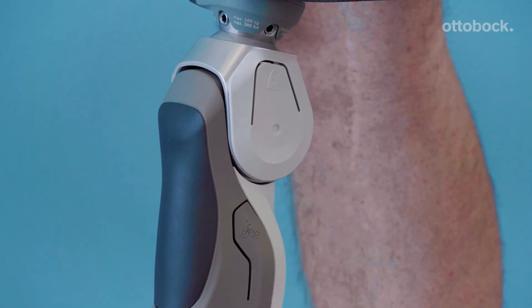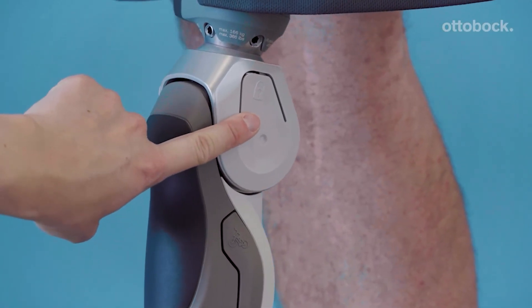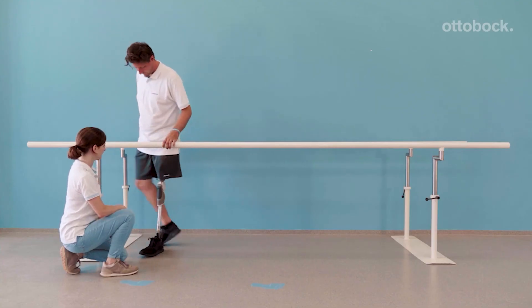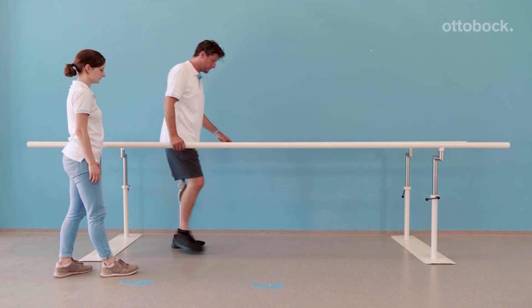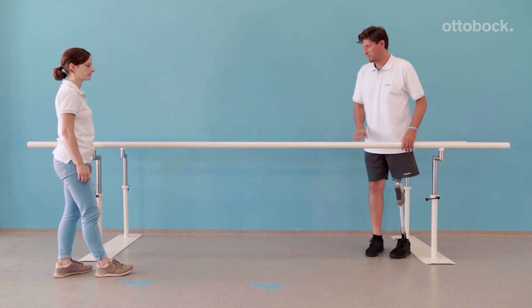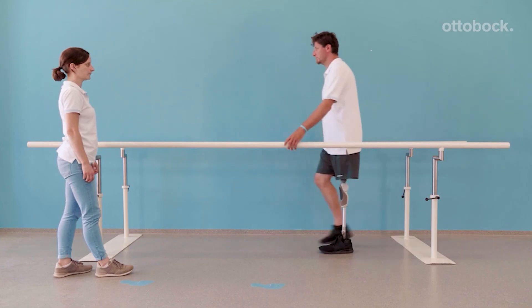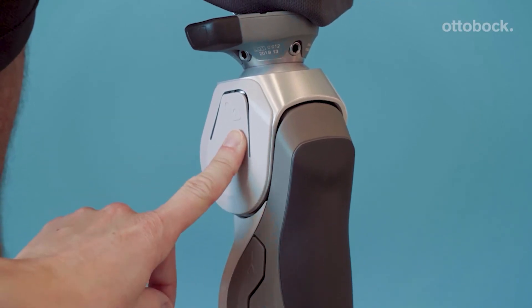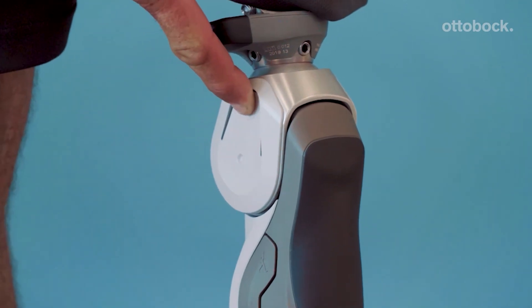To activate the lock mode, have the knee extended, push the lock button, and listen for the click. Use carefully. The knee is locked and stance release cannot be initiated. To disengage the lock, push the unlock button and carefully verify that the knee is unlocked.